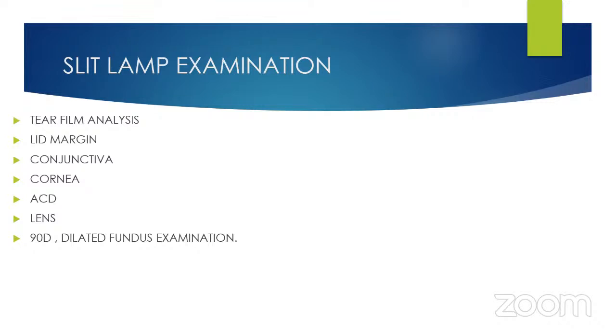Then complete 90-diopter examination as well as dilated fundus examination is done, especially because in high myopic patients, there will be a risk of pathological myopia, degenerative changes. If there is any lattice or break, prior laser is important in such cases.